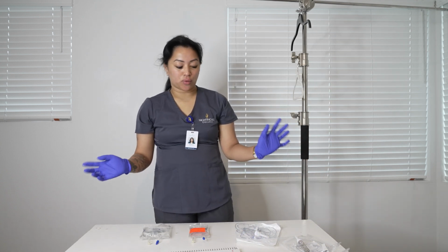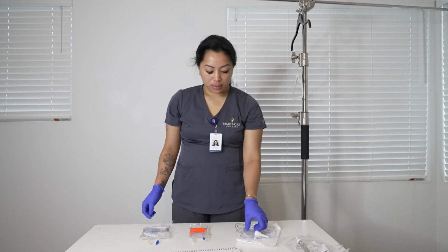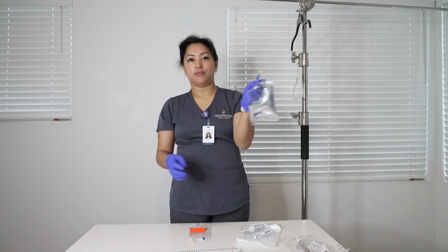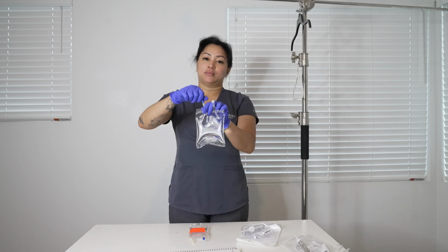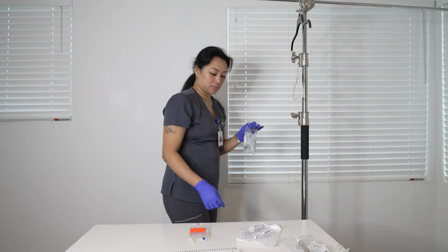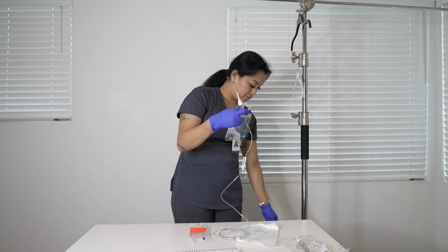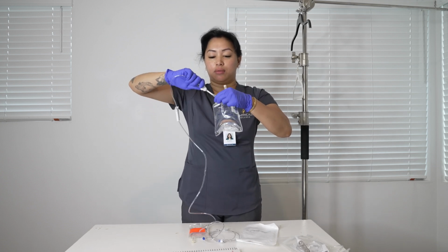Okay, so now I am going to prime my fluids. So this is my fluids right here. I will take out the cap from the fluids. Now I am going to take out the spike cap. Now I am going to insert the spike into the fluids.